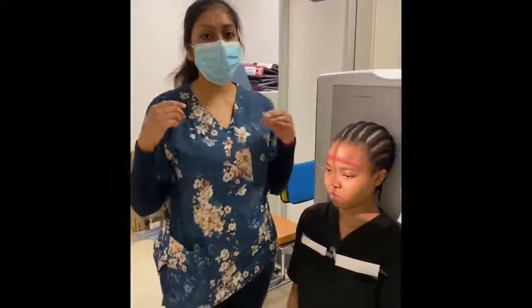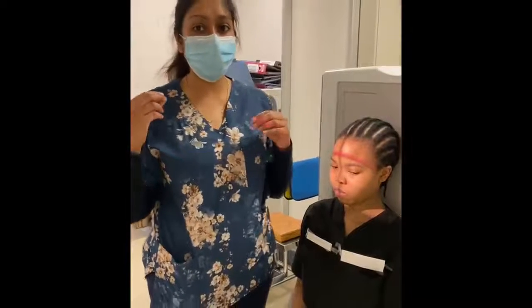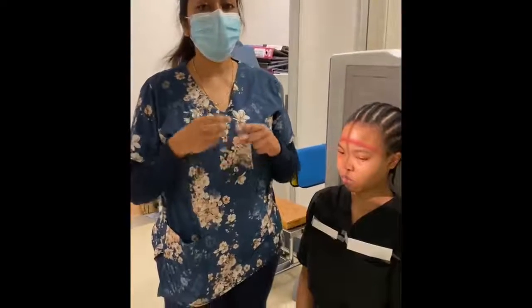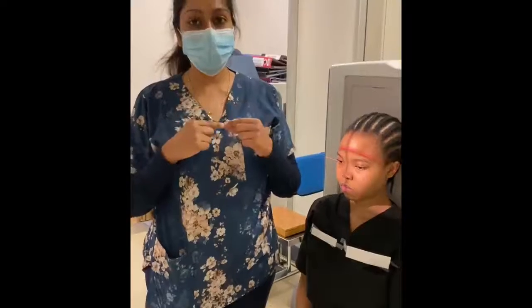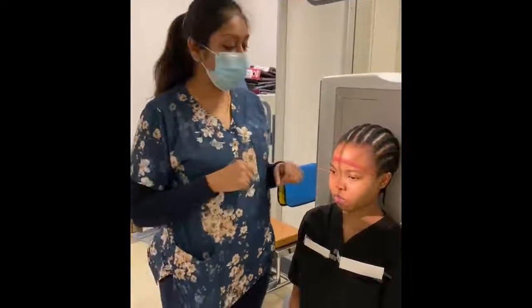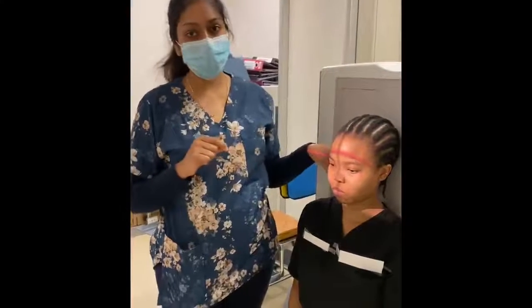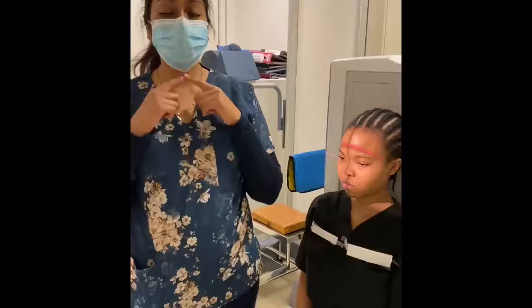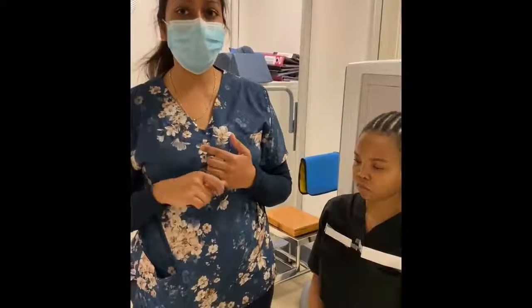Again, the tube angulation depends on whether your patient can tuck the chin in or not. If your patient can tuck their chin in, then we're going to use a 30-degree caudal angulation, and we're also going to bring the OML perpendicular to your image receptor. If your patient cannot tuck their chin in, then we are going to use a 37-degree caudal angulation of your X-ray tube.